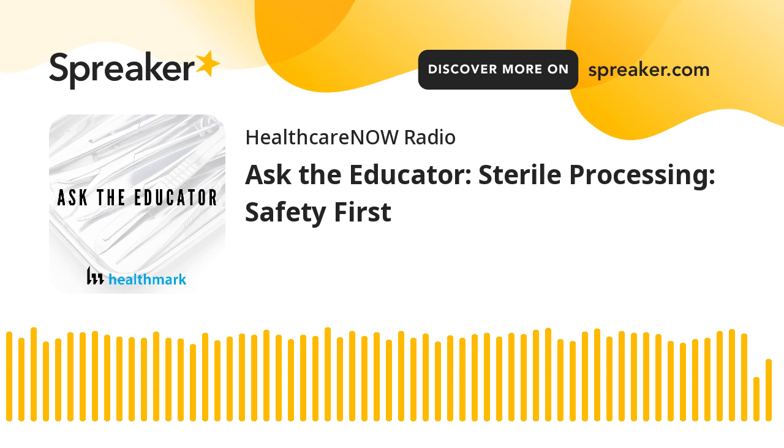Yeah, that's one of the first things I tell students when I teach the certification classes. It's the first thing I tell them before they go live into the facility: you're going to see people going really fast. It's going to look like light speed to you when you start, but you have to go incredibly slow when you're taking those instruments out. You don't know where the sharps are, right? Because they're little tiny sutures, little tiny blades that are attached to the blade handle. You might see the handle, but you don't see the blade attached to it. So there are a lot of sharps injury risks in our departments. And again, you're right.